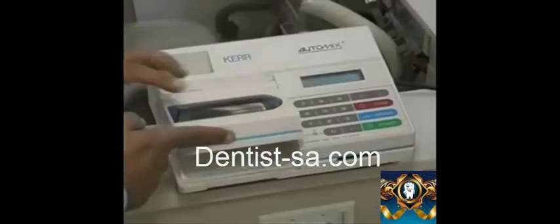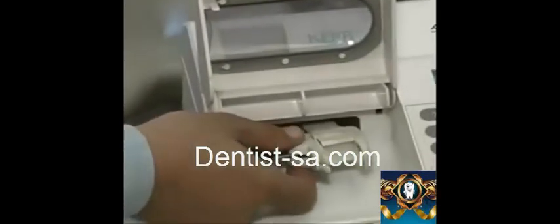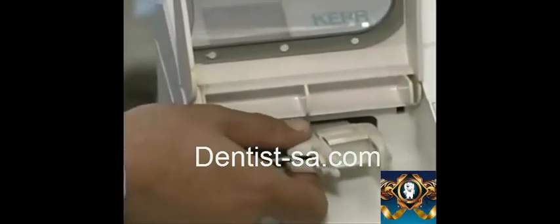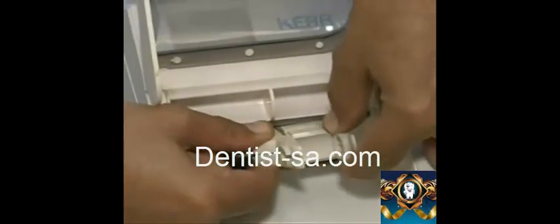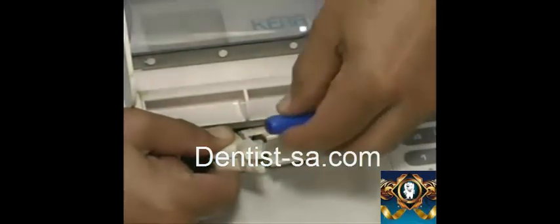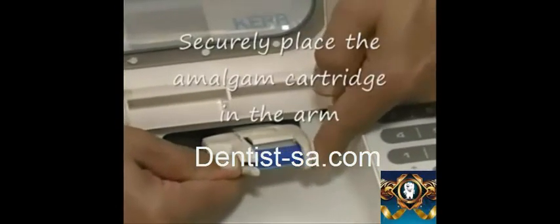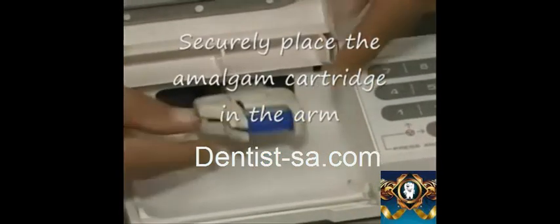Open the window and locate the amalgam carriage, which has a sliding part on the left that adjusts to hold the amalgam cartridge in place. Place the amalgam capsule in the carriage and slide the carriage holder to the right so that the cartridge is securely held within the carriage.